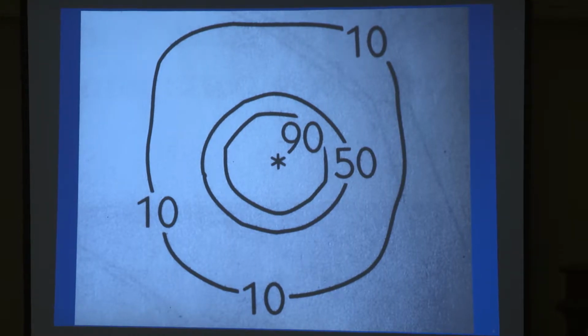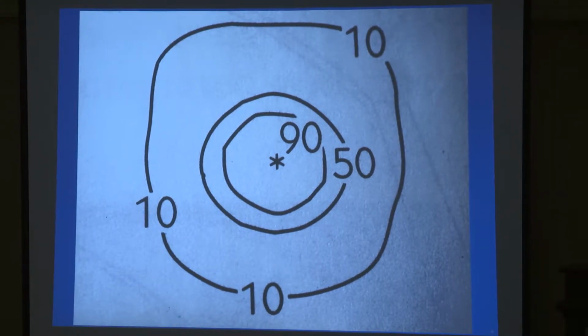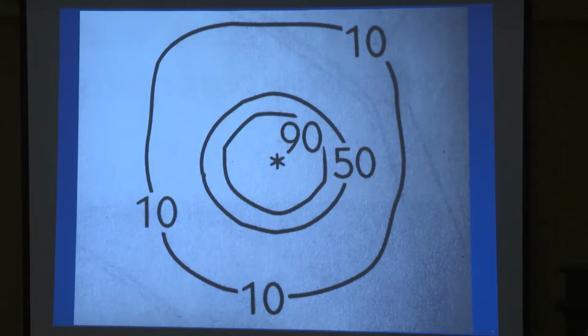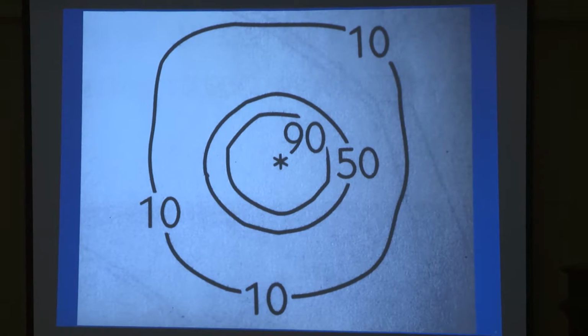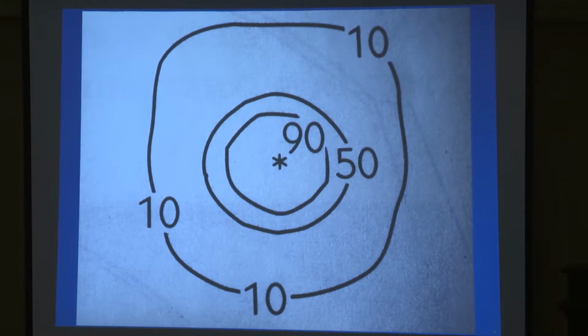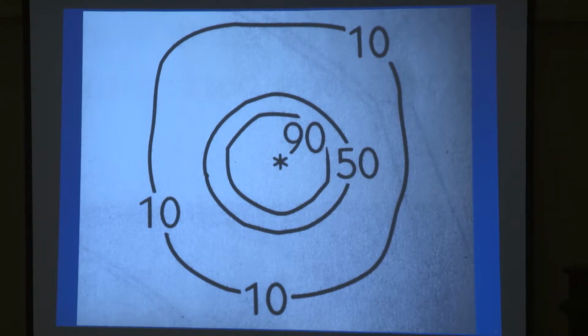So there are 3 key features to stereotactic radiosurgery. The first is that the radiation we're going to deliver is super conformal to what we want to treat. If the thing we're treating is a circle or a sphere, this would be perfect. But again, it's going to be very conformal. Second, the radiation fall off is very, very fast. From the area of interest, let's say the 50% is where the tumor is, we want the radiation to fall off very quickly, so there's almost no radiation within millimeters of our area of interest. And the third feature is that the treatment is going to be done in 1 and up to 5 sessions.